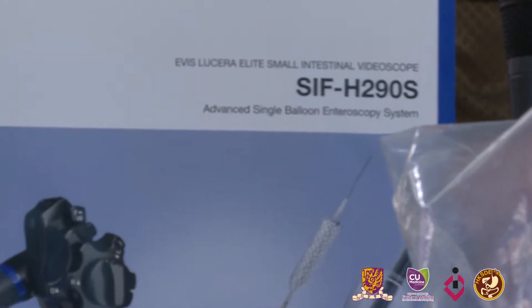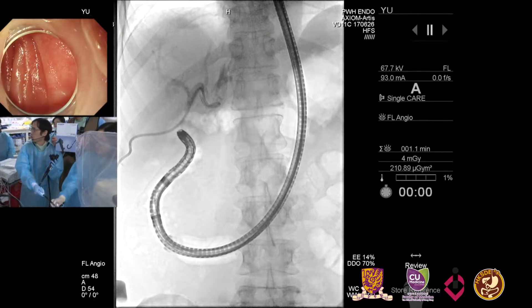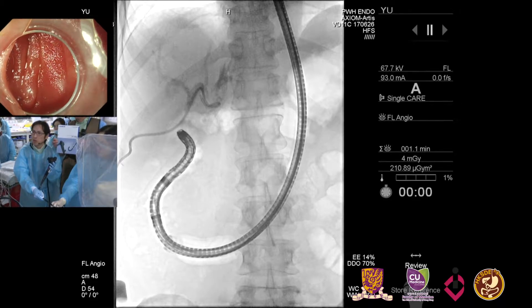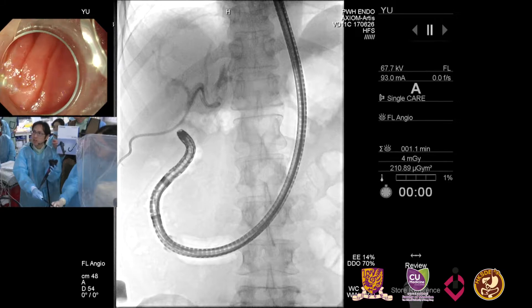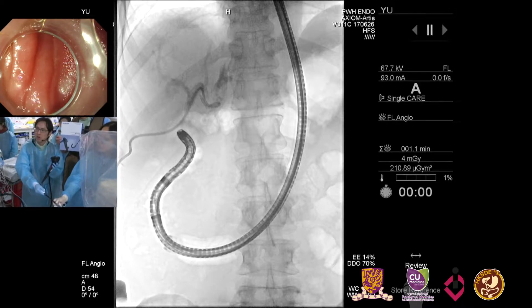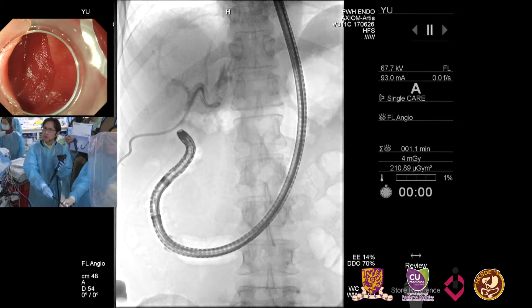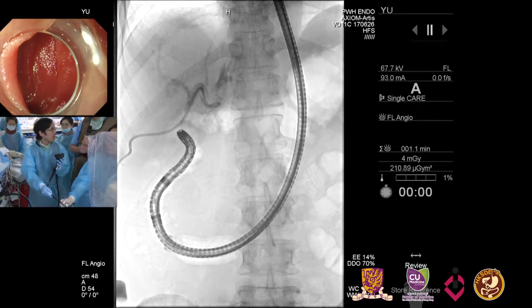There are some features that make this scope unique. The outer diameter is 9.2mm but we have a 3.2mm channel. This is an improvement from the prior standard single balloon scope which only features a 2.8mm channel. So you can pass more instruments than before — we can use standard ERCP instruments.